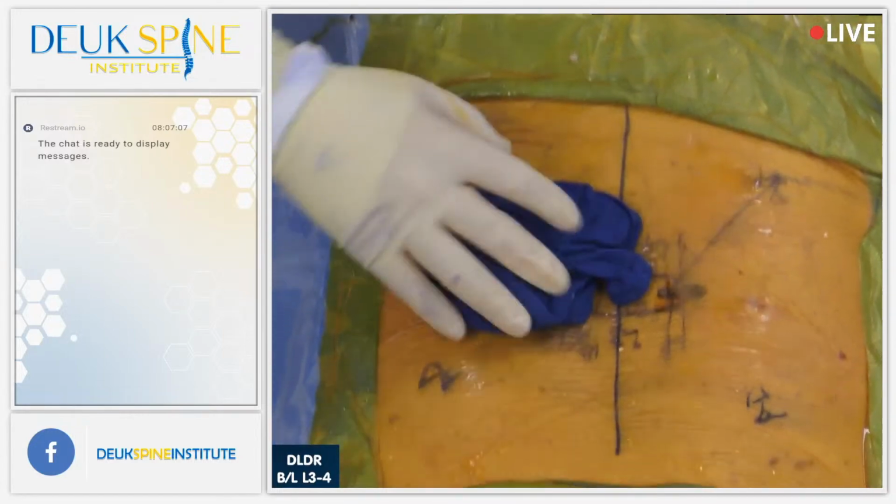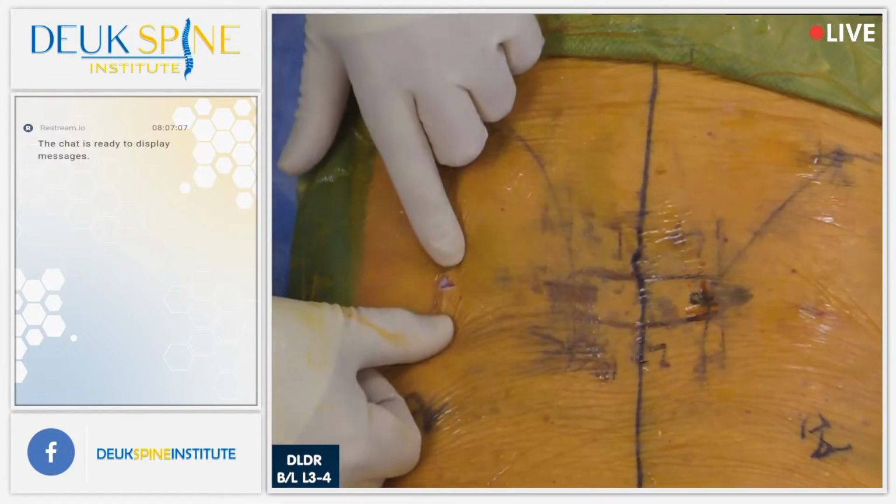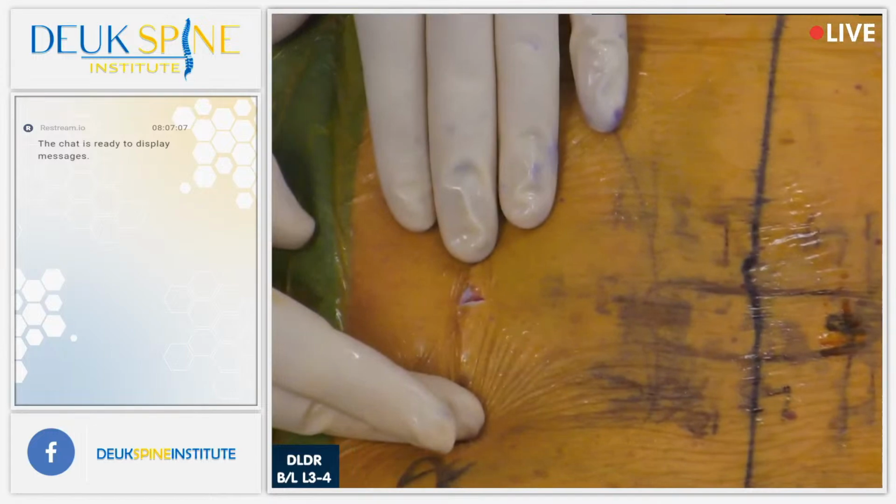Blood pressure control is very important during these surgeries. All right, take a look here. That's your incision, folks. Look at that.